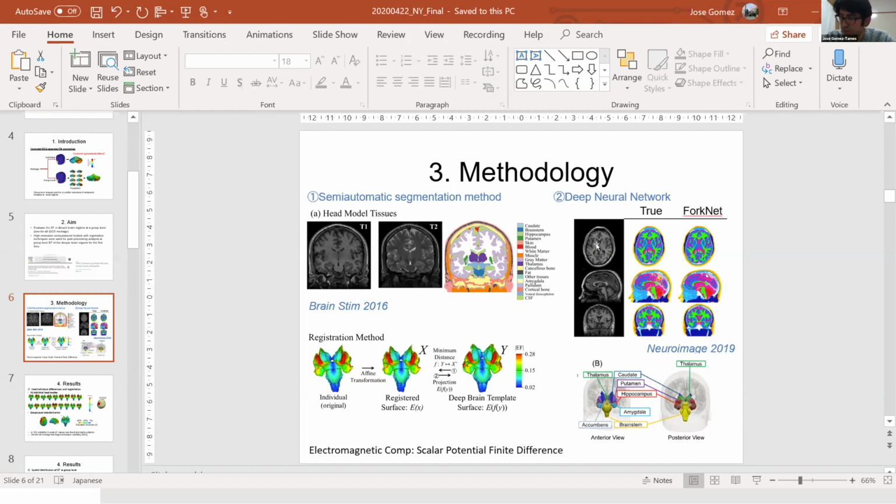So we used the common montage, and we applied this for all the subjects. So they were a fixed montage, and they were not optimized for the patients. They were applied like we would use in a clinical trial. So even though the electrodes were not optimized for each subject, it was possible to find these consistent hotspots. Okay, thank you.